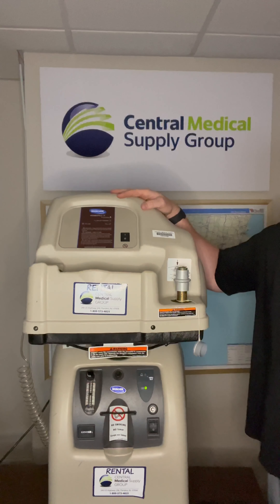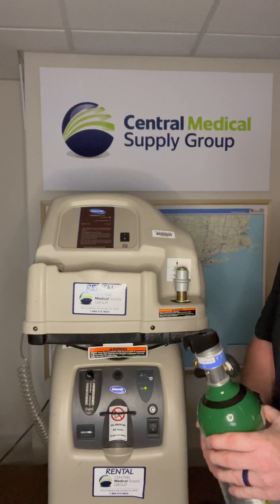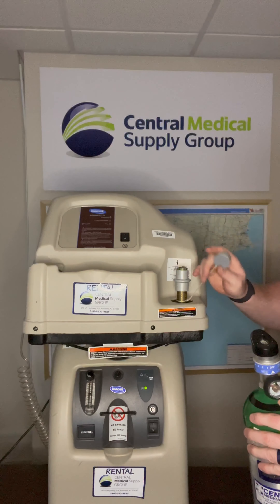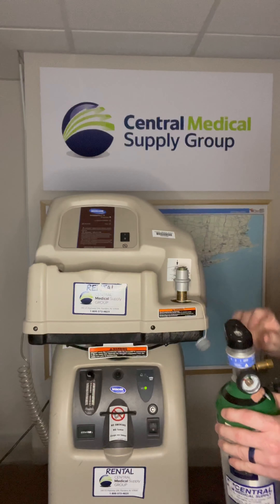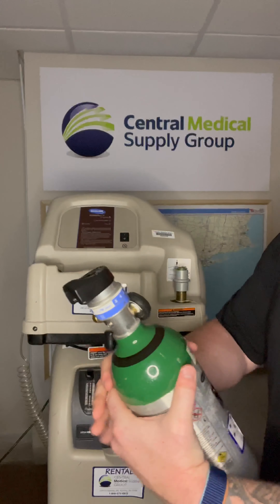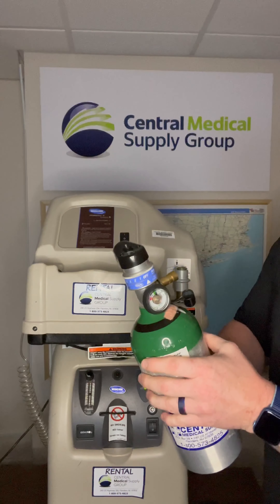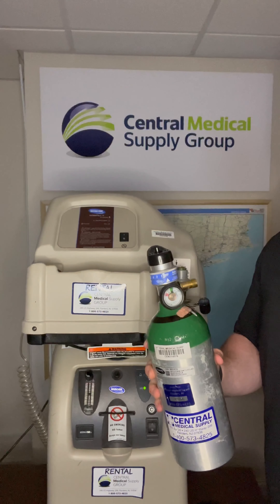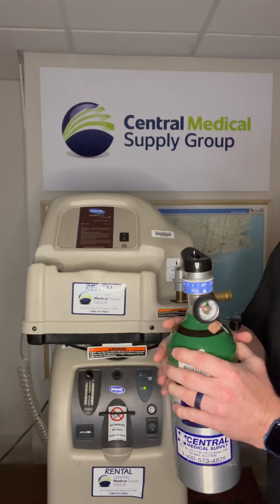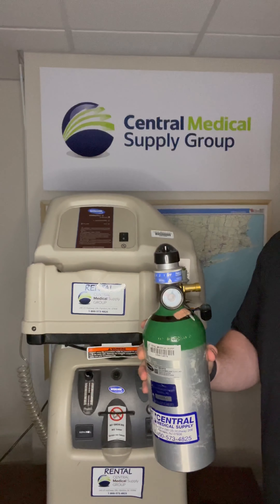Attach one of the two tanks provided to the top compressor unit. Remove the dust cap from the tank filling outlet, both on the tank as well as the top compressor piece. Turn the conserving regulator to the off position. Be sure the pressure gauge on the regulator reads 1,000 PSI or less. If not, turn the regulator to two liters per minute continuous and let enough oxygen run out until the gauge reads 1,000 PSI or less. This may take several minutes.